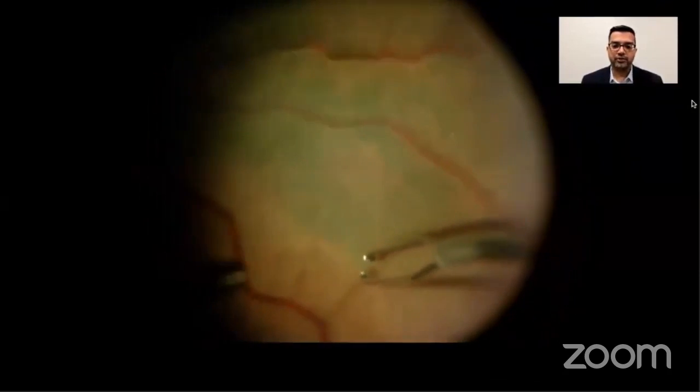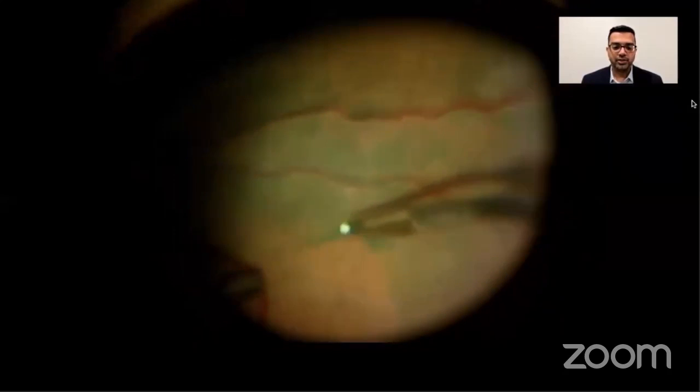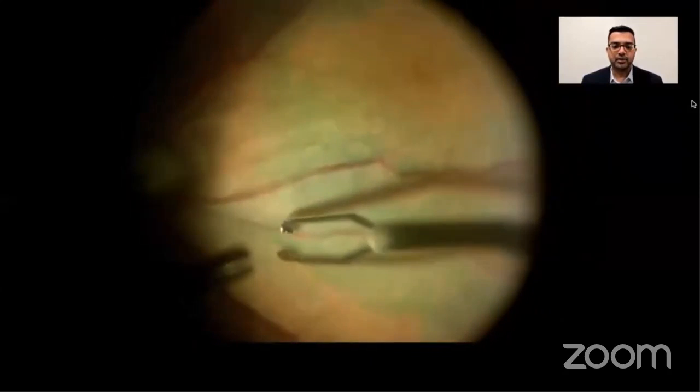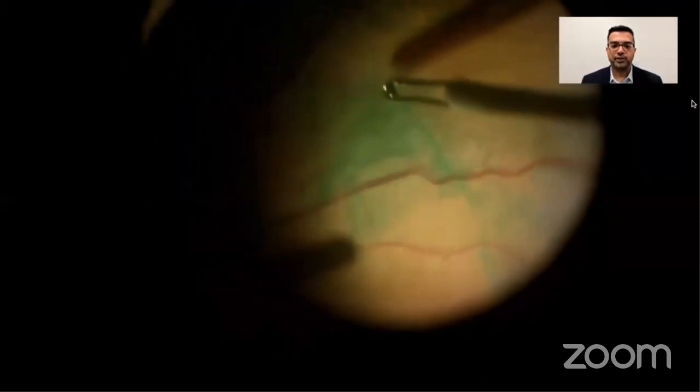Using 23, 25, or 27 gauge end-gripping forceps, the internal limiting membrane and ERM are peeled in a broad-based fashion, not necessarily fully arcade to arcade, but as broad as we think is necessary, and in as atraumatic a fashion as possible. We peel the membranes off, hopefully in one sheet, as shown here.